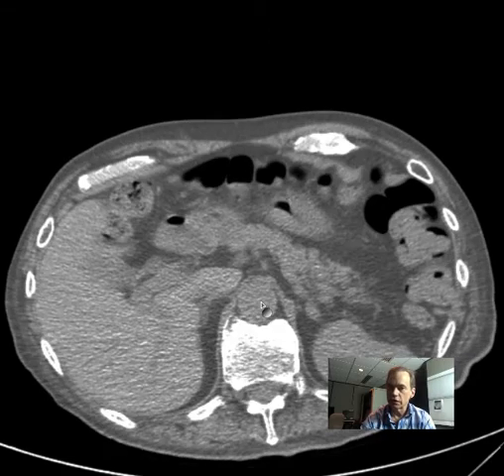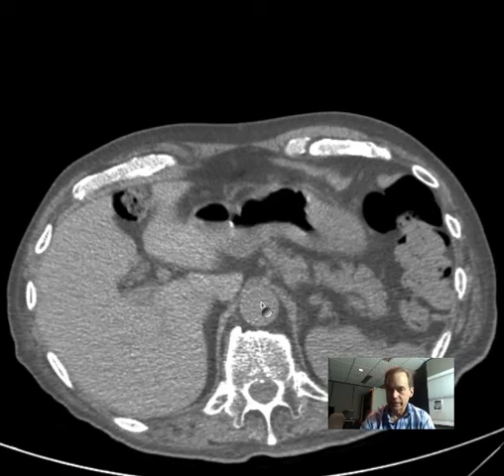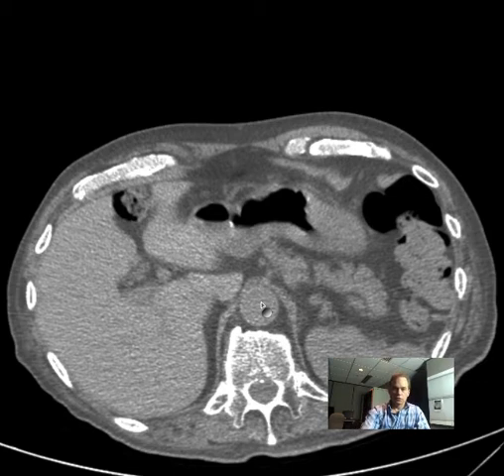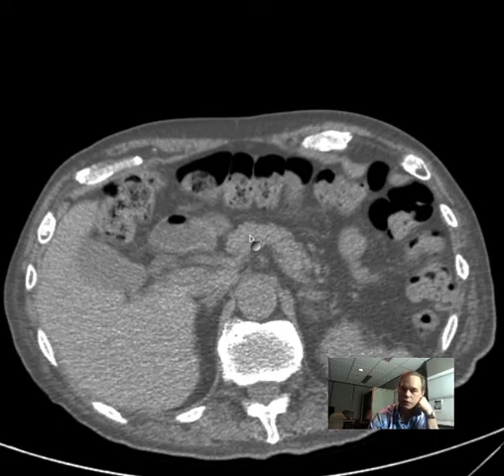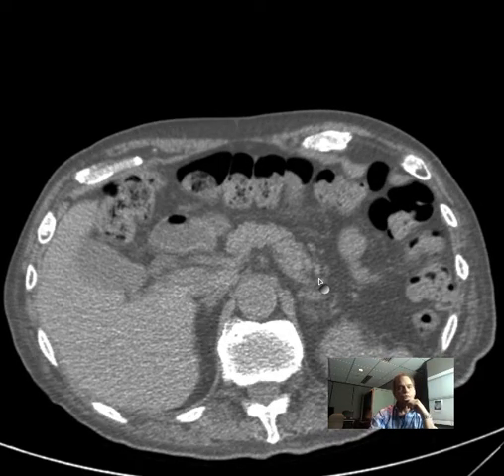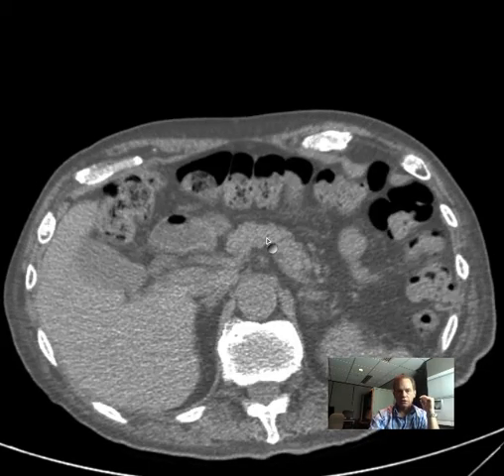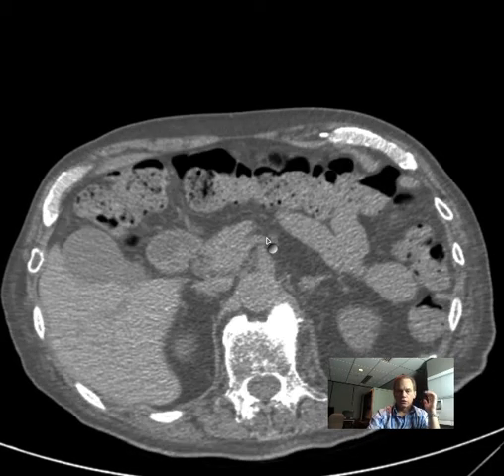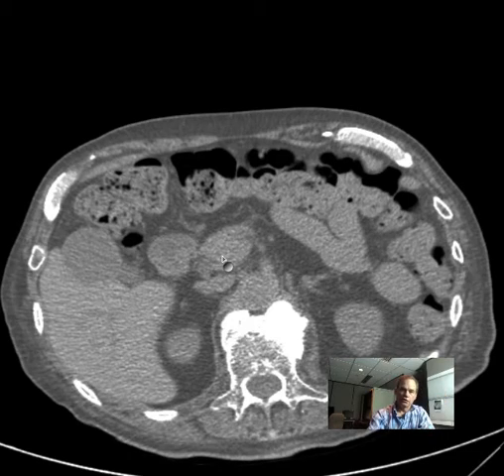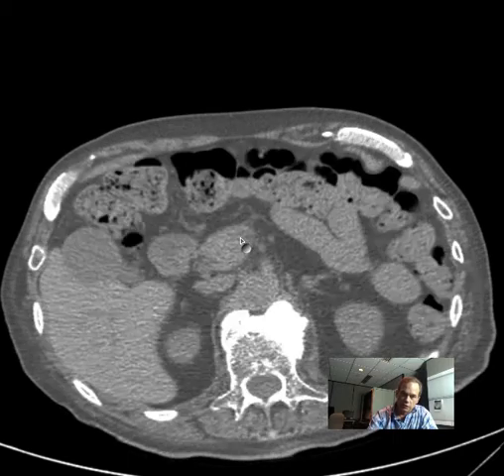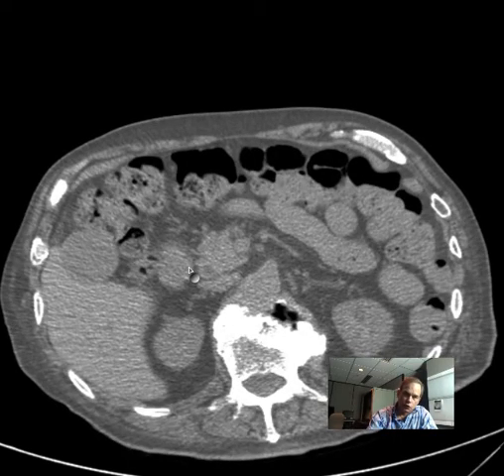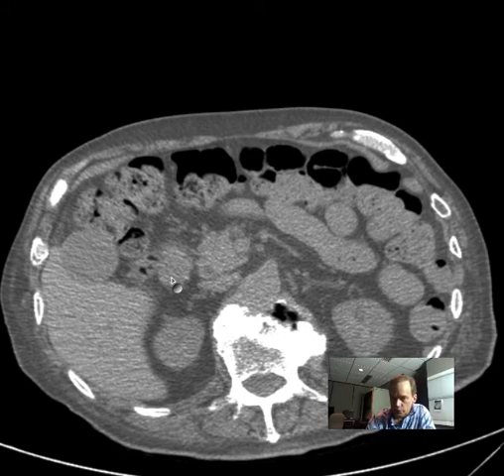Let's follow the aorta down. This is harder on non-enhanced CT, but it's good for you to master — if you can see it here, it'll be much easier on IV contrast. Going down: what is this structure? That is the pancreas. You can see it become prominent in the pancreatic head region, with the second portion of the duodenum next to it.